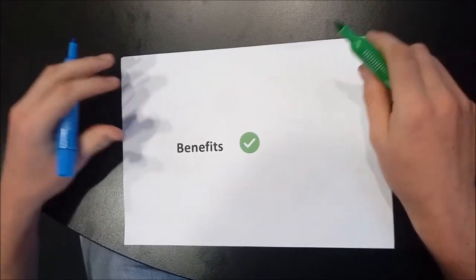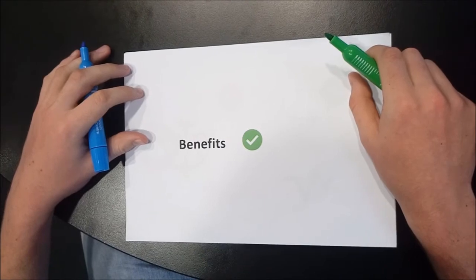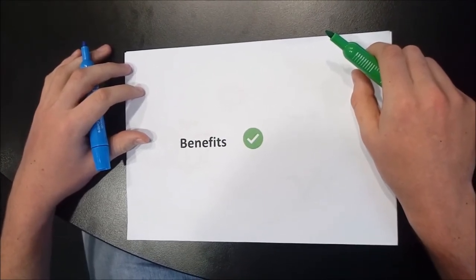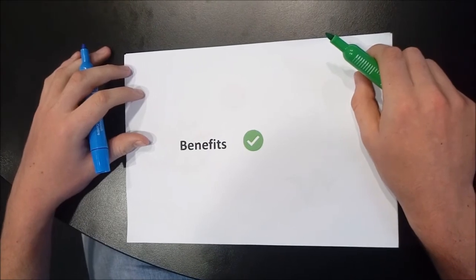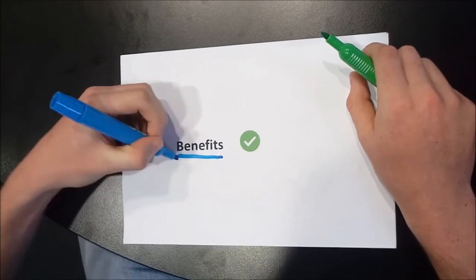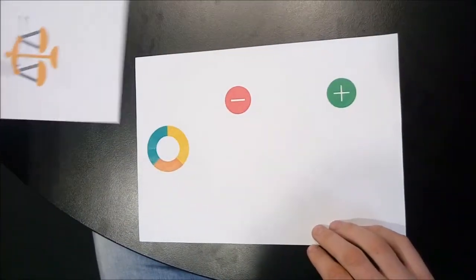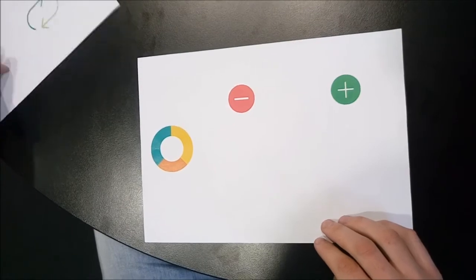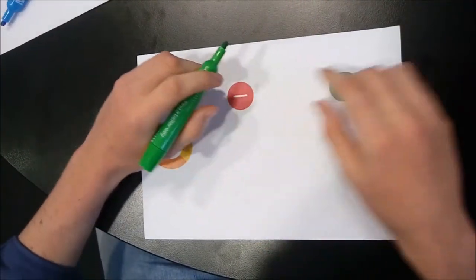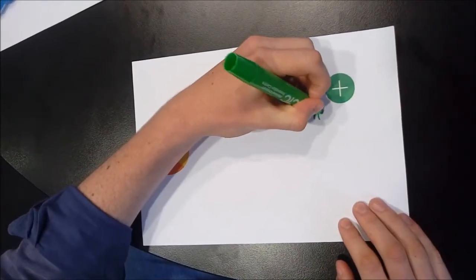Pacemakers have become one of the most widely implemented and trusted medical technologies. Through the use of pacemakers, patients with various heart conditions can have their life prolonged and general quality of life improved. Thus, the benefits of pacemakers are numerous. However, these vary depending on the existing condition the pacemaker is attempting to rectify and the other aspects of the patient's health. The major benefit provided by a pacemaker is the establishment of a normal sinus rhythm or heartbeat.